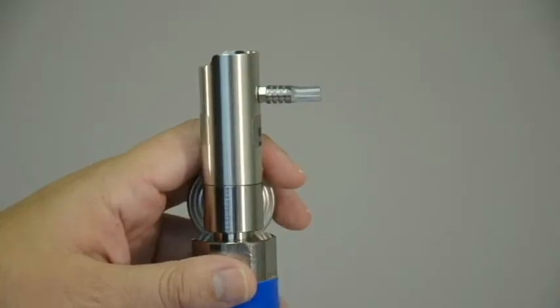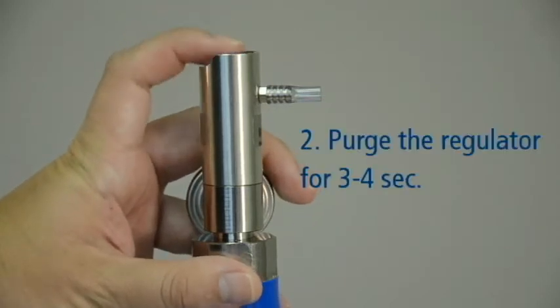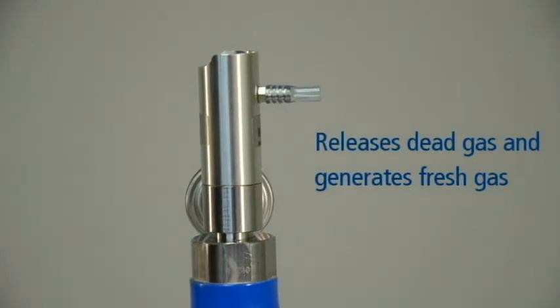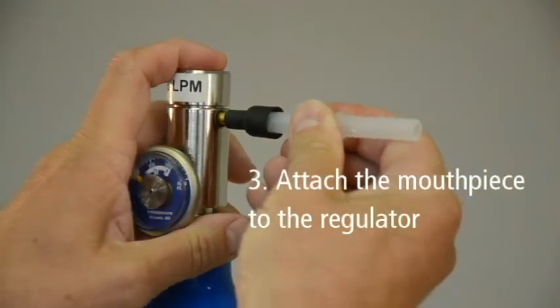Before performing the accuracy check, it is important to purge the regulator. This is done by pressing and holding the button or valve on the regulator for 3 to 4 seconds. Purging the regulator releases any dead gas that may be present and generates fresh gas for the purpose of your accuracy check. Next, attach the Alkosensor 3 mouthpiece to the regulator tube.